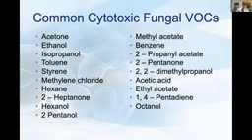The reason it's so important to not only capture, but completely remediate and destroy fungi, mold, etc., is because if they're continuing to grow, they may be captured, but if they're continuing to grow above the space you're trying to protect, they can be a very significant source of fungal VOCs. This is just a short list listed here, many of these proven to be cytotoxic. But again, the reason you want to strive towards destruction versus capture of the fungal or microbial VOCs is so that they can no longer be a source of cytotoxic VOCs.